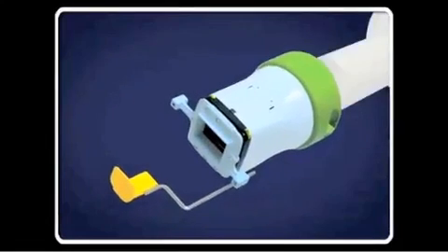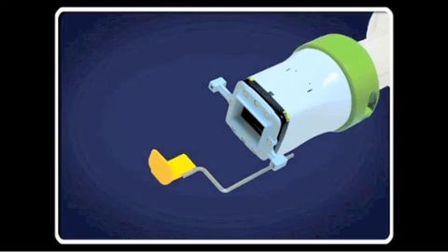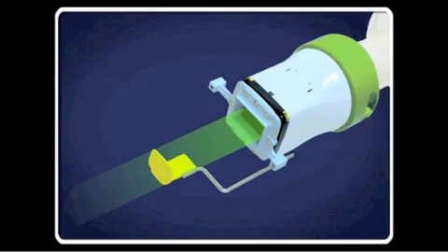TruAlign is a rectangular collimator that slides over the cone of your existing x-ray system to shape and control the size of the x-ray beam to the size of the receptor.